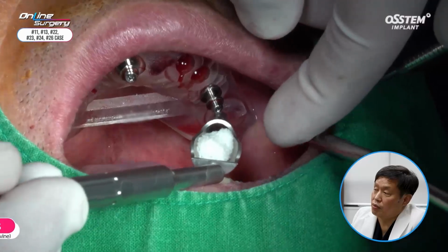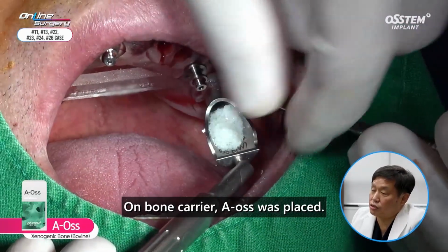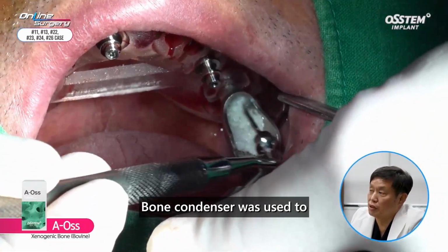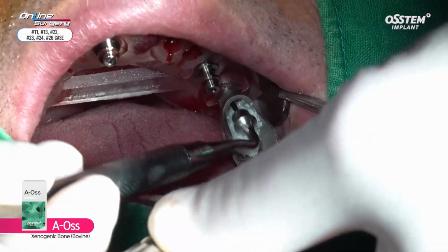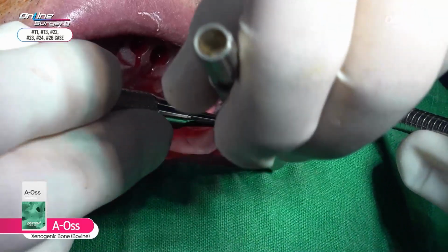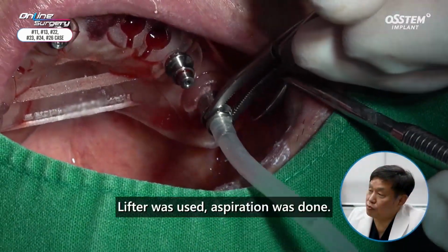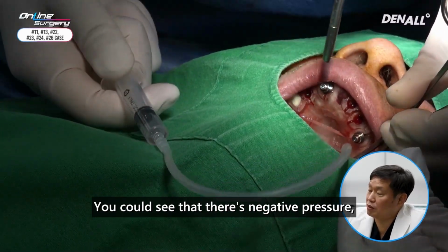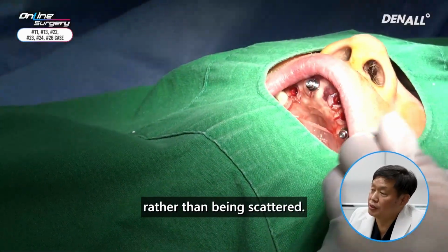Bone graft was done. On bone carrier, A-Oss was placed. Bone condenser was used to perform bone graft. Lifter was used, aspiration was done. You could see that there's negative pressure and graft materials are concentrated rather than being scattered.